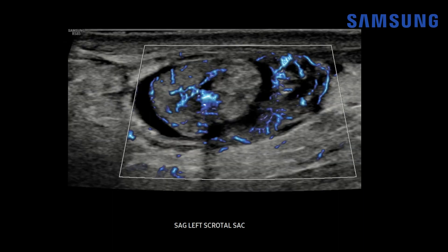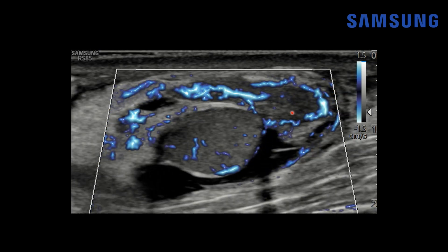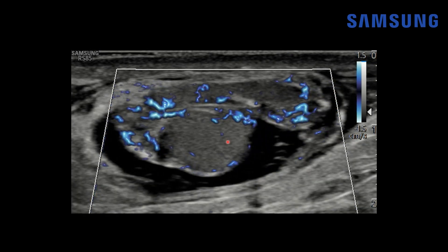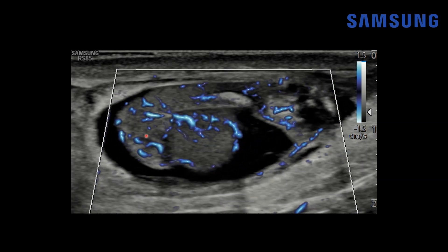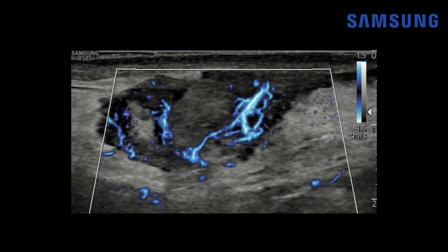Power Doppler flow is even more sensitive and again shows no flow within the appendix, but hyperemia in the adjacent epididymis. This is an example of microvascular flow imaging, which is excellent at detecting slow flow in small caliber vessels. On the Samsung RS-85, it is known as MV flow. You can see it exquisitely showing hyperemia within the epididymis and surrounding structures, but no flow within this enlarged heterogeneously echogenic torsed appendix. A cine clip again confirms hyperemia in surrounding tissues, normal flow within the testis, hyperemia within the epididymis, and then that torsed appendix right there.